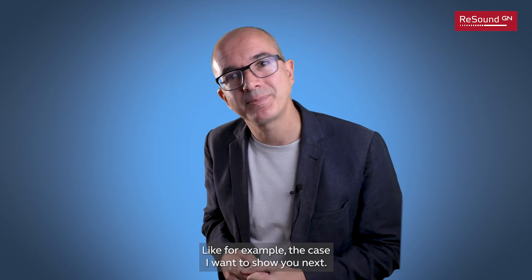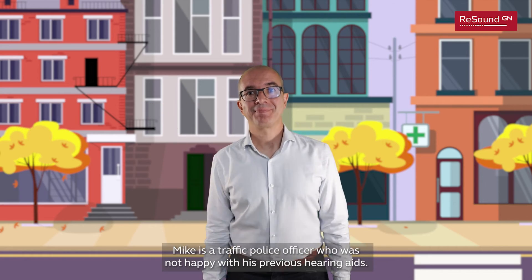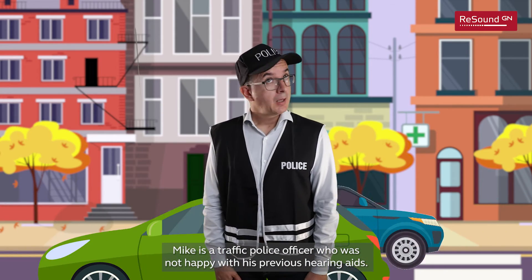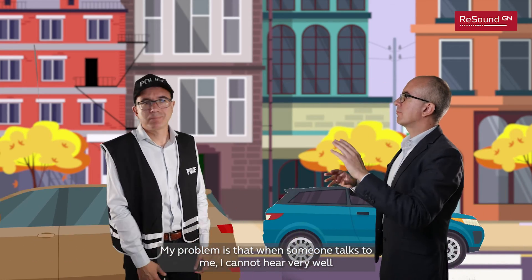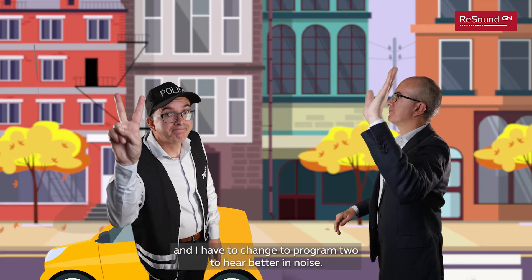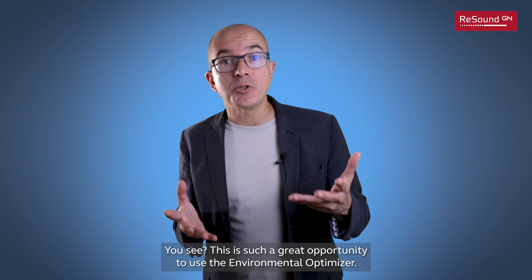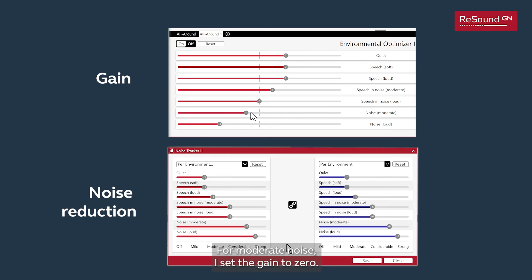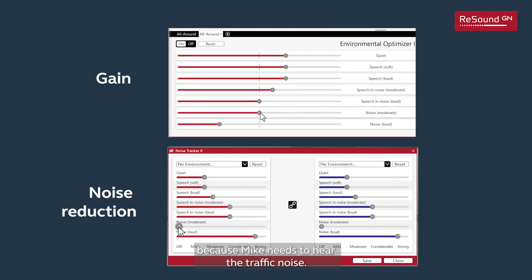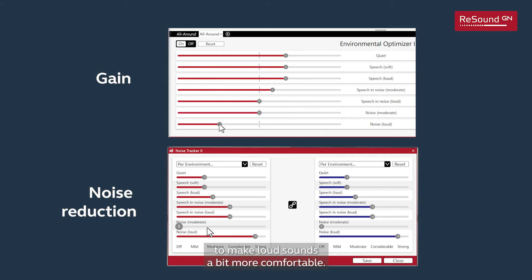But there are always people with particular needs — like the case I want to show you next. This is Mike, a traffic police officer who was not happy with his previous hearing aids. He said: 'In my job I need to listen to the traffic noise, and for that I use Program One. My problem is that when someone talks to me I cannot hear very well and I have to change to Program Two — this is too much trouble.' For moderate noise, I set the gain to zero and the noise reduction to zero, because Mike needs to hear the traffic noise. For very loud noises, I lowered the volume three decibels to make loud sounds a bit more comfortable.